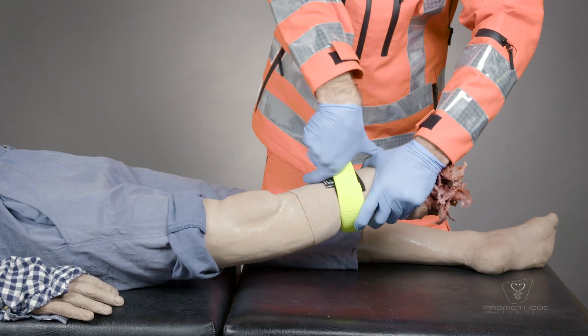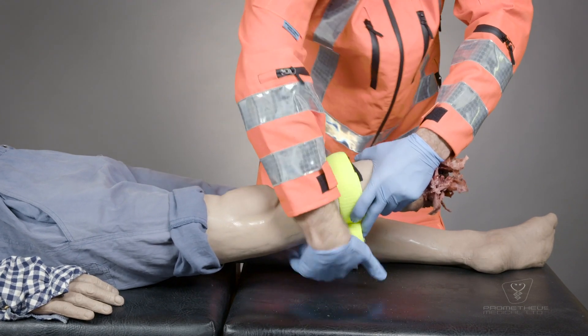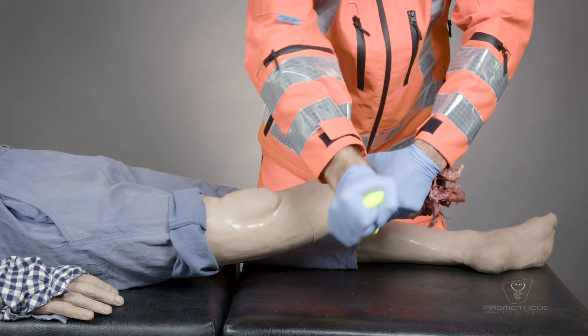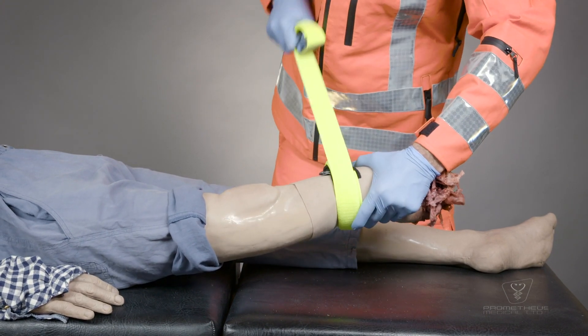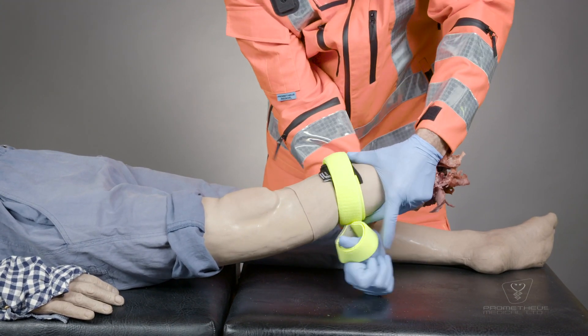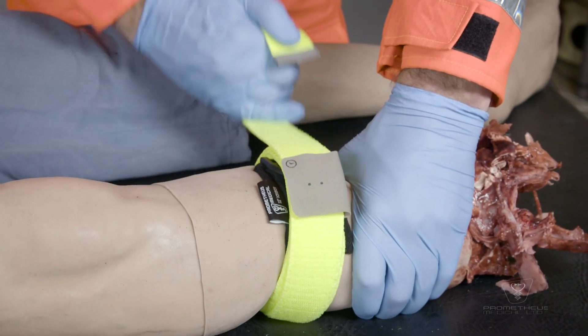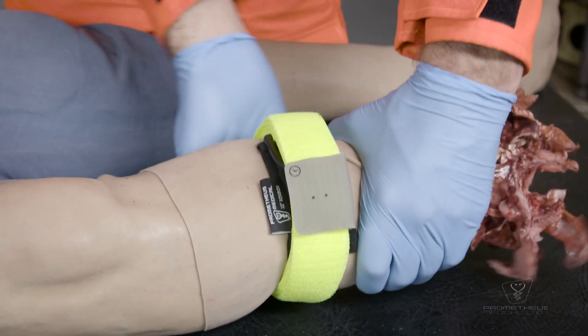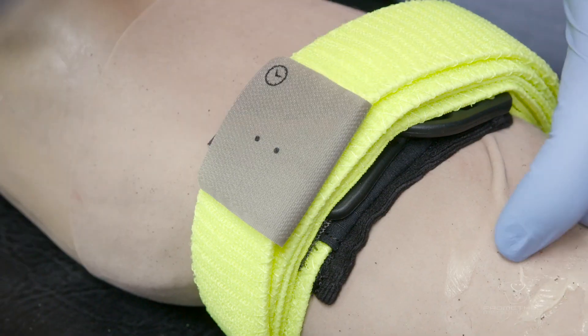Continue to stretch and wrap until the strap is fully used. Record the time of application on the tab provided.